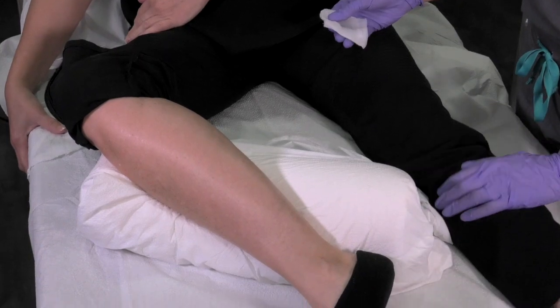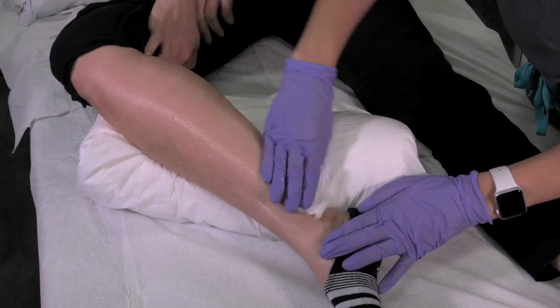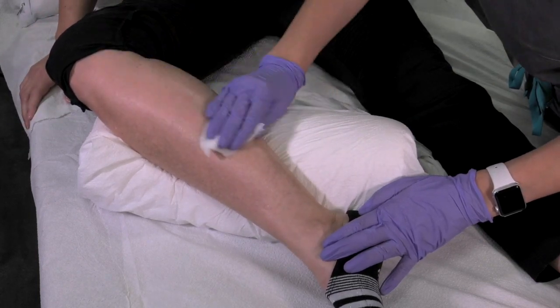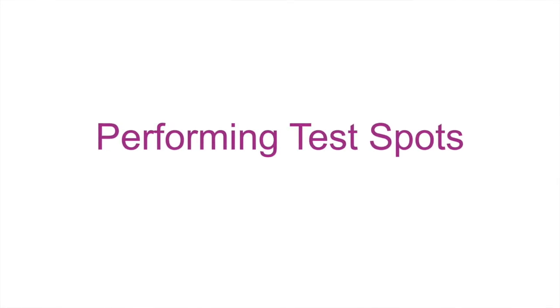The treatment area should be closely shaved and hair-free. Remove any lotions or residue from the skin and ensure treatment area is clean and dry. You are now ready to begin treatment.